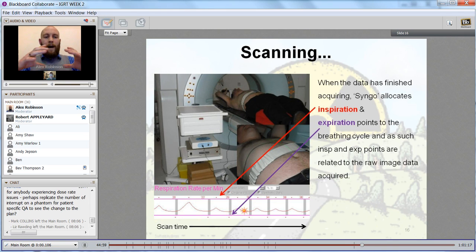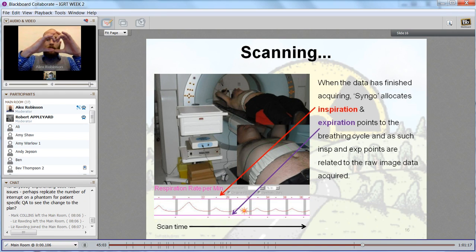When you're trying to put a band around and there's this hollow gap here, you don't get compression. So you end up putting the belt so far in that you're not actually getting diaphragmatic motion, you're just getting abdominal motion. And then you've really got to query, the trace will be nice and straight, but the data, I'm not convinced that is a true reflection of tumor motion.